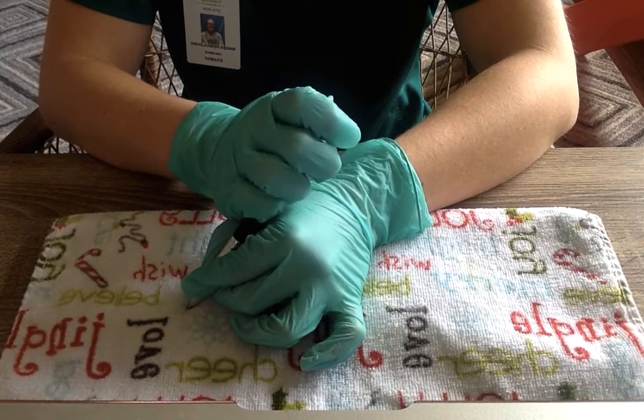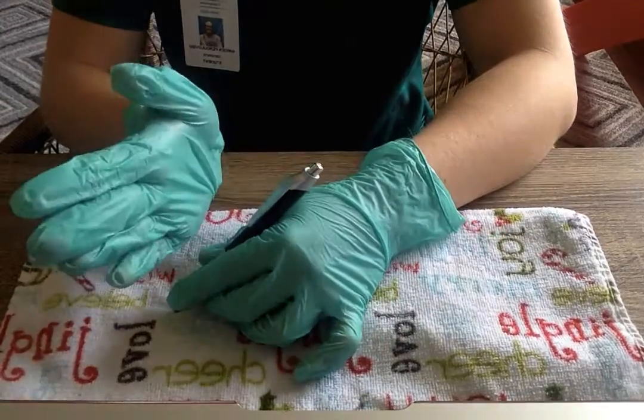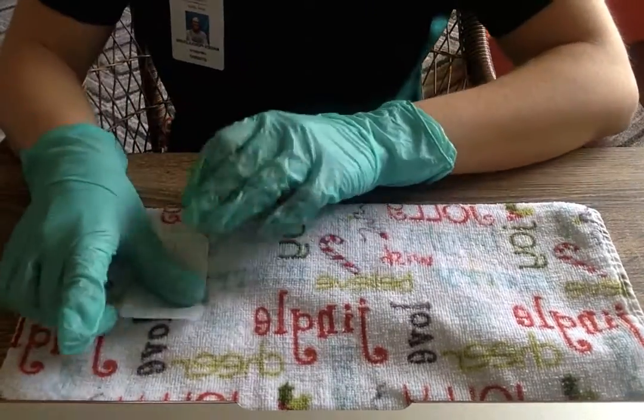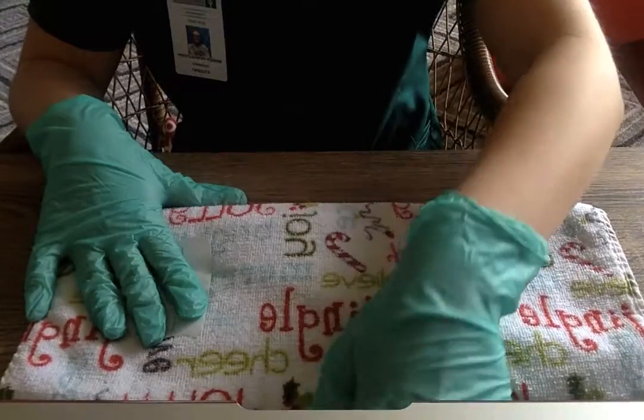And if no blood is present in the syringe, then you are good, you are successful. So then you go ahead and take it out, get your gauze, apply pressure, not massaging, just kind of applying pressure.